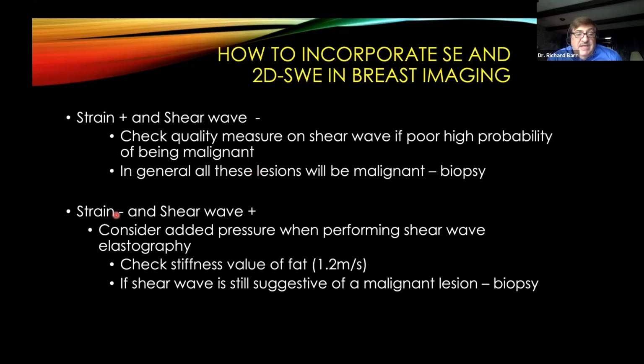If strain is negative and shear wave is positive, which I don't have very many cases of, consider that you added too much pressure when you're doing the shear wave elastography, and the value of fat should be about 1.2 meters per second. But obviously, if it still comes back after you release some pressure, malignant lesion, you should biopsy it.